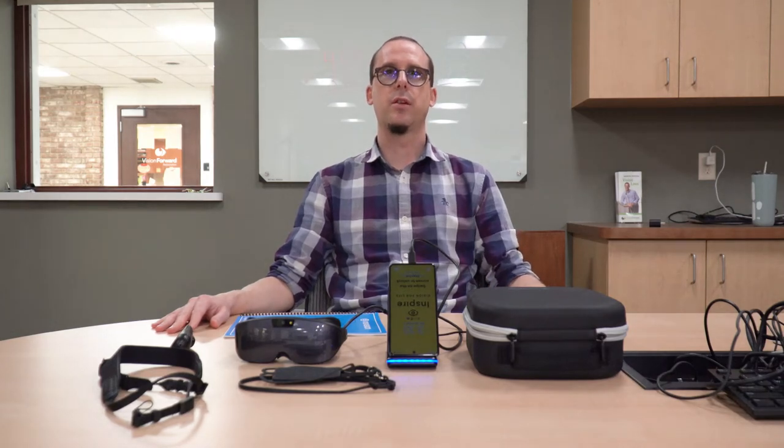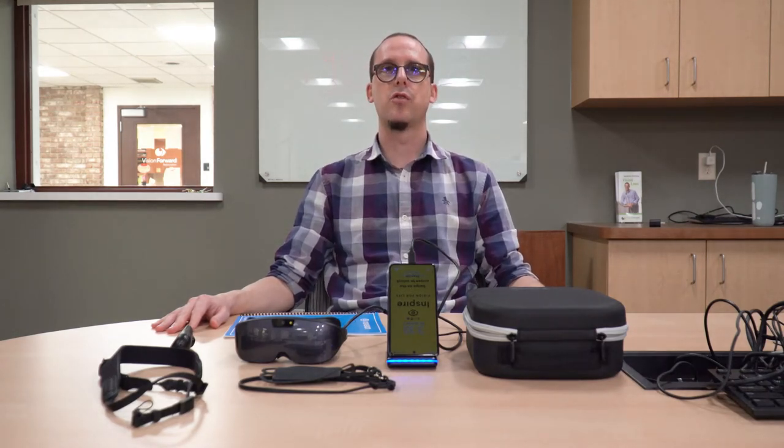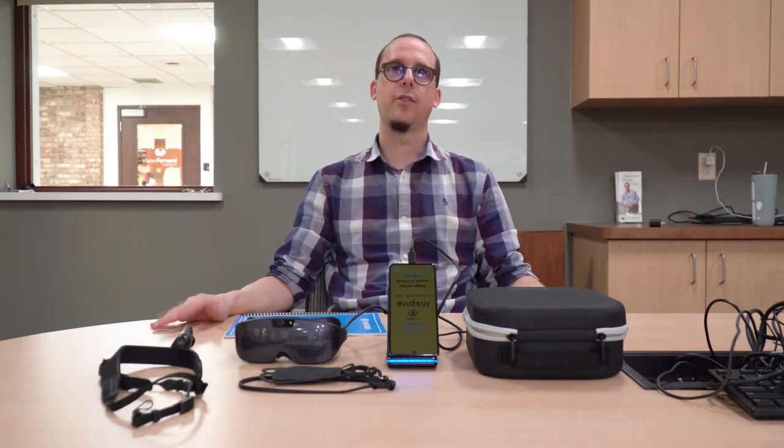Hi everyone and welcome back to the channel. Today we're going to be looking at the IrisVision Inspire, a new wearable electronic magnifier from IrisVision. But is it any good? Let's take a look.